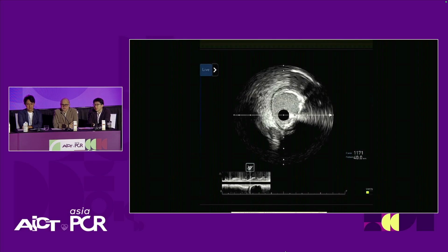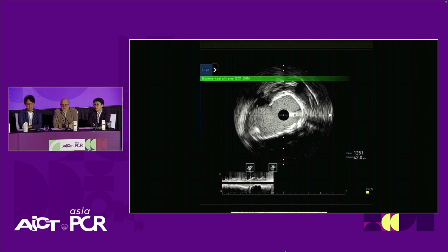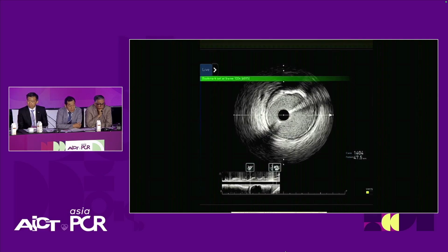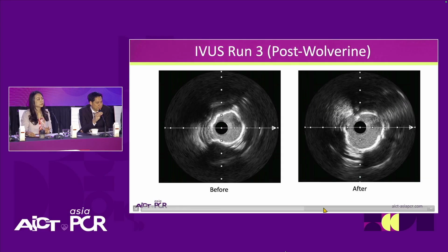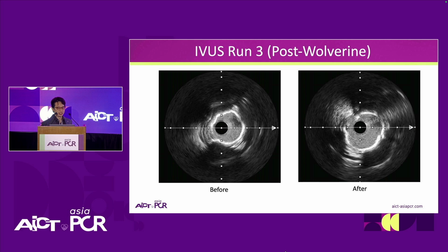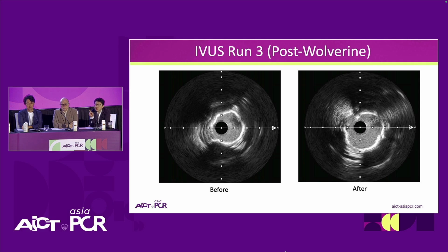And I think that really gives us confidence now, seeing these cracks. Dr. Narate, is it ready for DCB or DES? Yes, it is very beautiful. I think we are ready. Okay, so Mark, let me just pause here. Jason, you were commenting on where the fractures are seen, and the reverberations, the location. Yes, this is a very nice slide which shows where the three cutting elements are, really applying that focus force that Dr. Naratip showed us in his earlier slide as well. So you can see the nice effect from Wolverine.